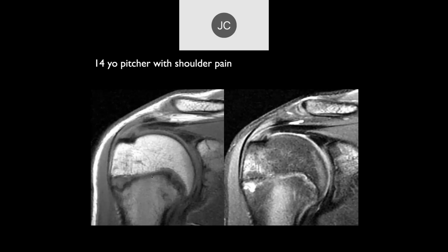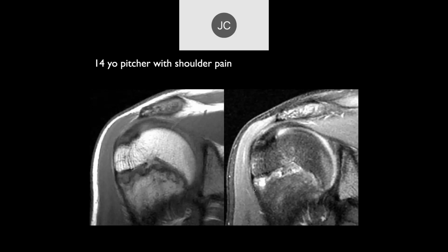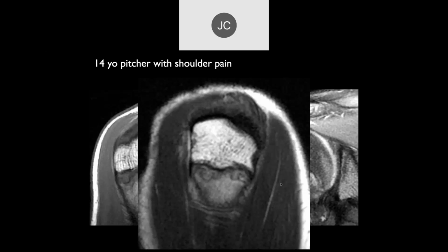Good. So this is really a Salter-Harris 1 fracture involving the growth plate. You can see that this is chronic and repetitive because you're getting a lot of erosive changes here. Normally, when we just see a Salter 1, the margins are smooth like we saw in the previous one. But if you continue to irritate it and not let it heal, you end up with these erosive changes, which is characteristic of Little League shoulder, where the player is pushed to continue to pitch by his coach, often by his parents, and by himself, to pitch through the pain.